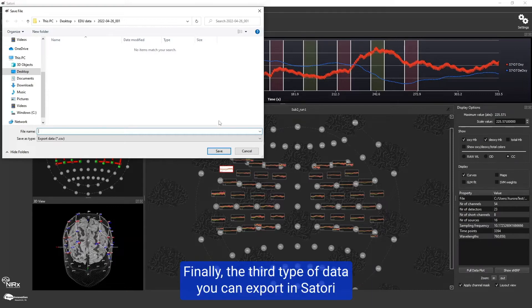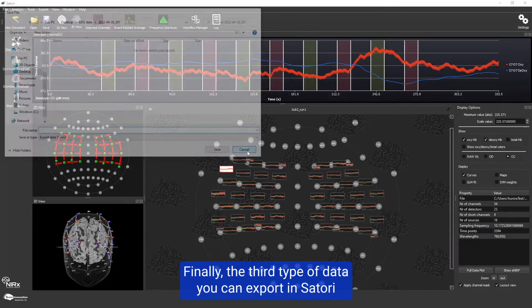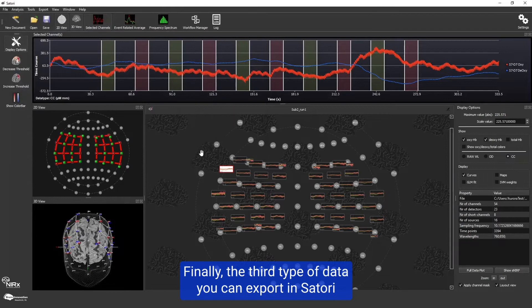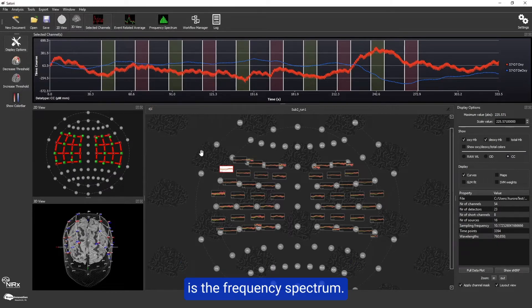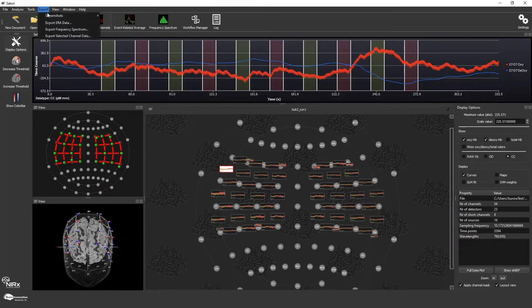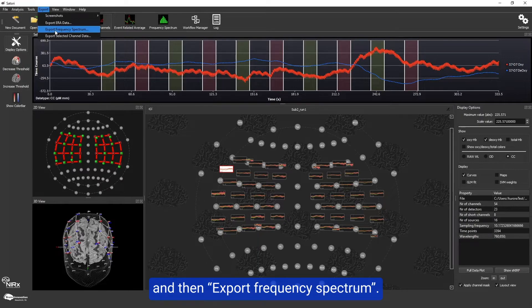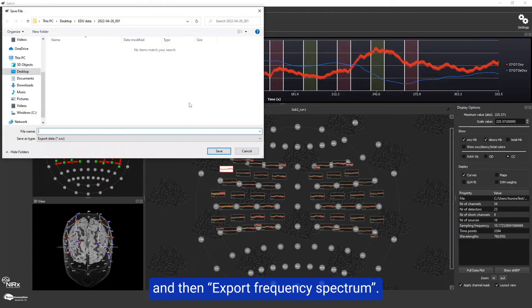Finally, the third type of data you can export in Satori is the frequency spectrum. To do so, go to export again and then export frequency spectrum.